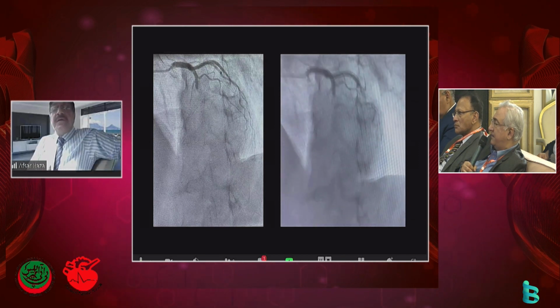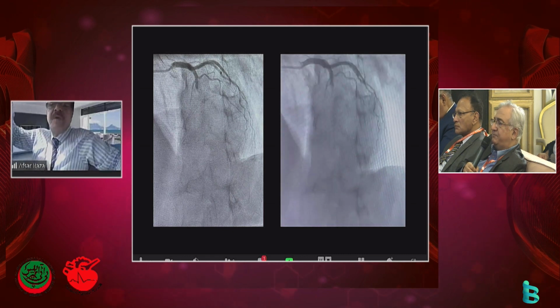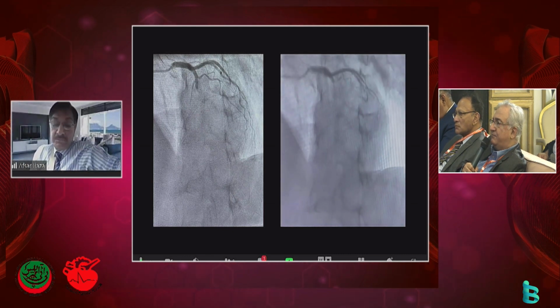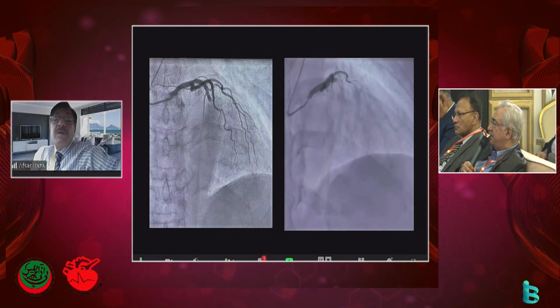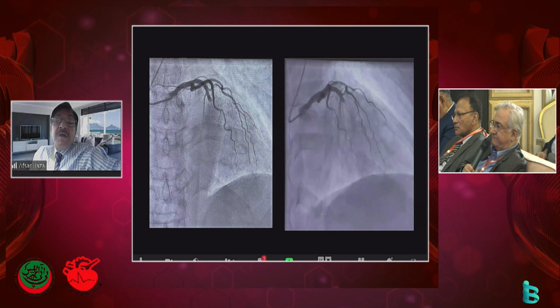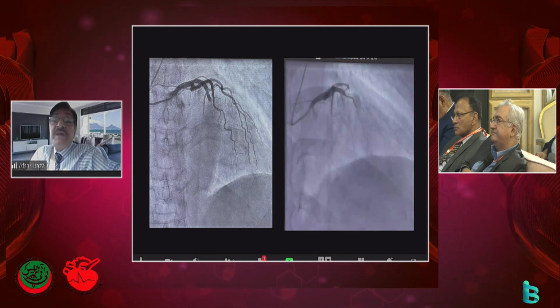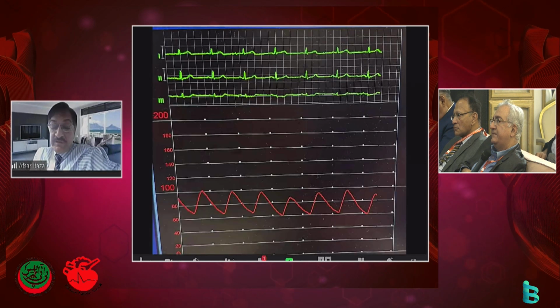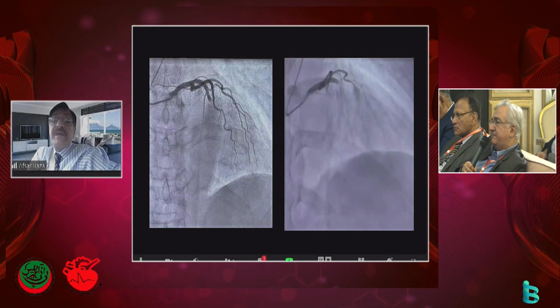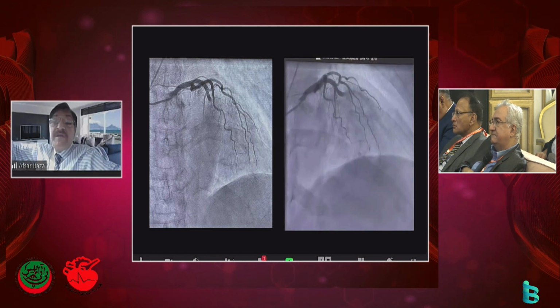Initially, because unless we de-air, sometimes I get surprised by it. Although techs in the UK would be much more efficient, lots of techs are very careless in how they de-air the system. So I think if you just carefully de-air the system. Or severe spasm. You see, I gave a forceful injection, and you see it's moving. Something is moving actually. So it must be air. Are you suggesting that air is basically visible?